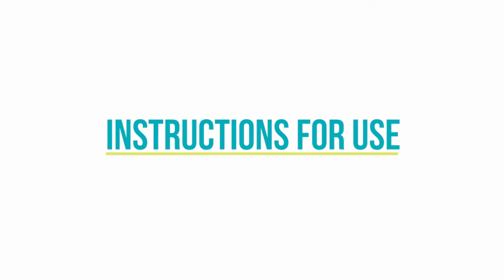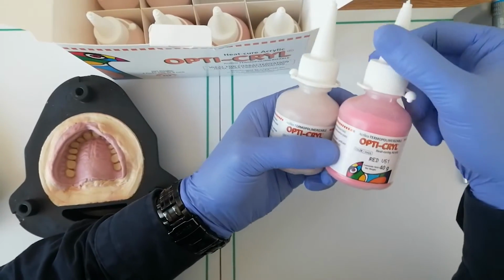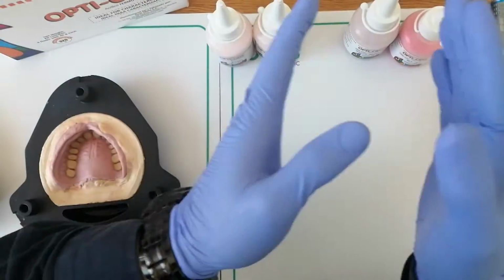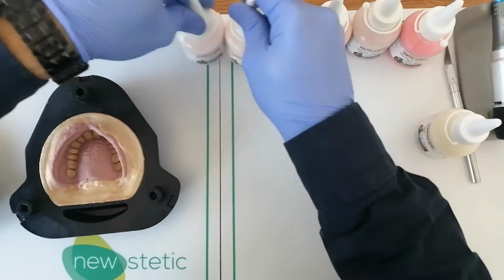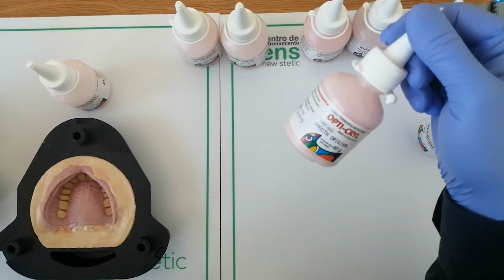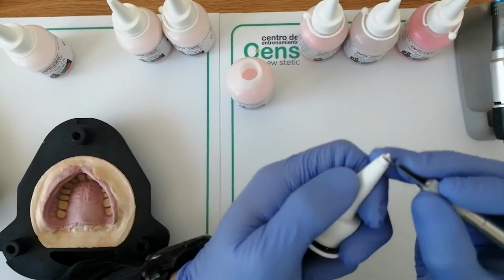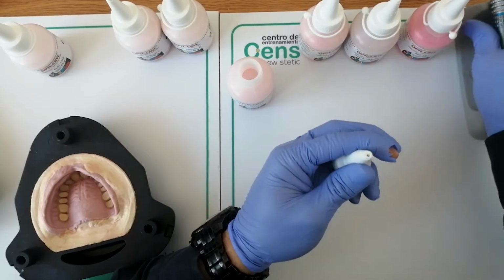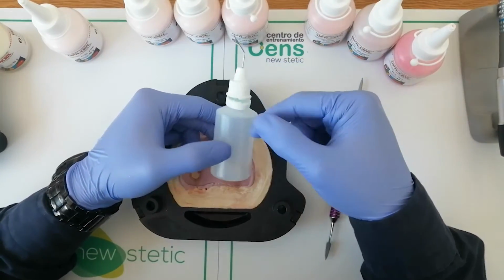Instructions for use. Opti-Cryl Characterization Kit is composed of 8 polymers in pink colors, organized in 3 groups of light, medium, and dark colors. Take the lid of each container and make a small puncture to achieve proper dosing of the powder. Prepare a liquid dosing container with a needle to be able to have drops of Opti-Cryl heat-curing monomer to moisten the polymer.